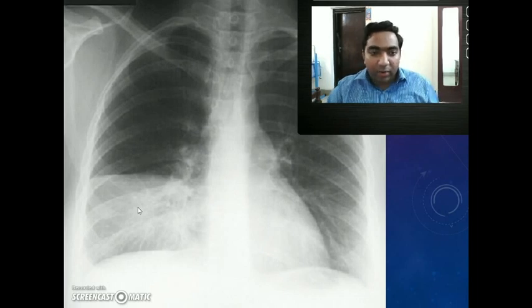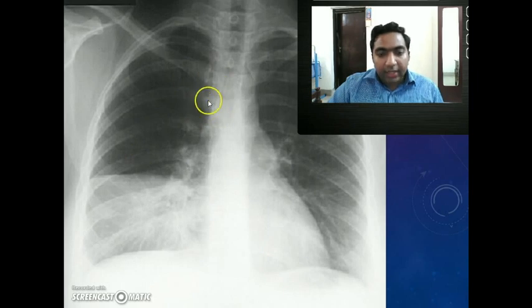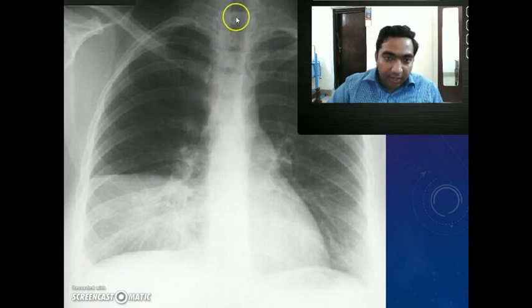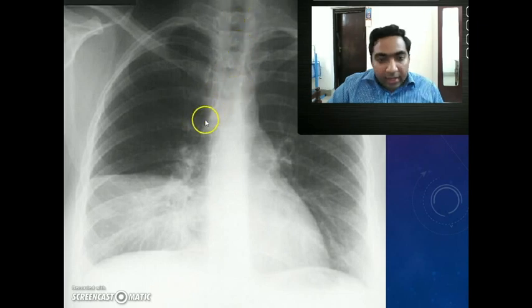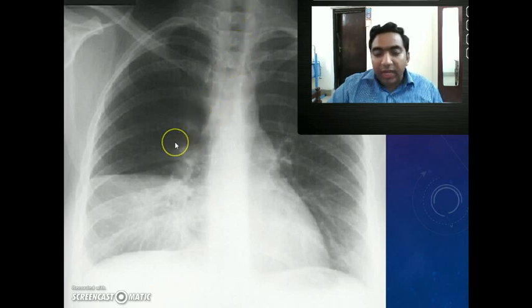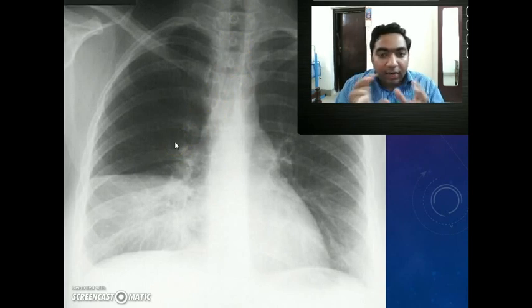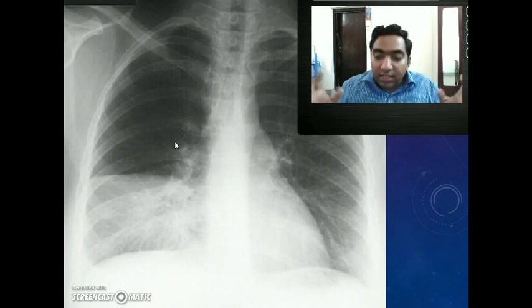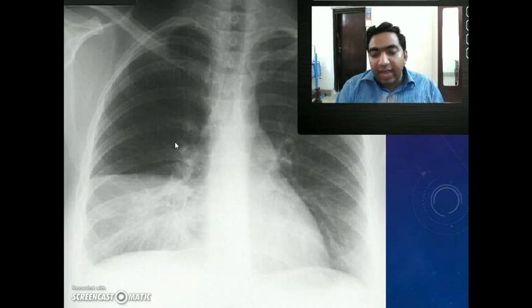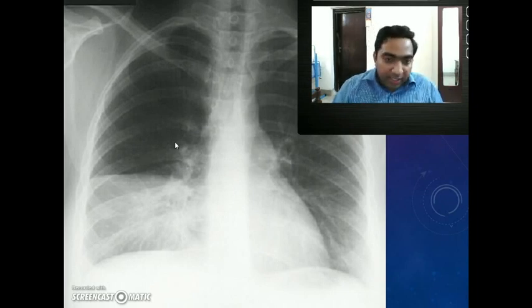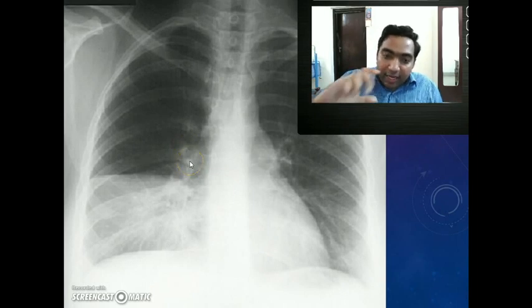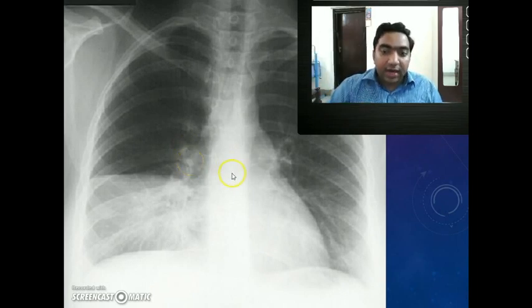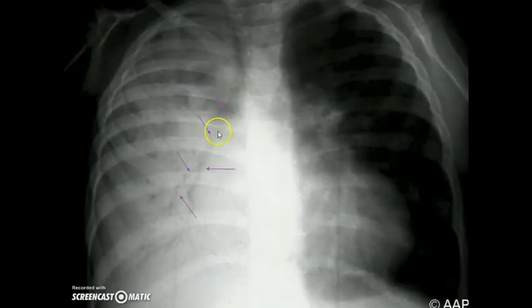What exactly is air bronchogram? There is a bronchus in the lung parenchyma. When the bronchus is in the trachea and mediastinum, we can clearly see the air. When the bronchus divides and enters the lung parenchyma, it is surrounded by air-filled alveoli — so we no longer see the margins of the bronchus because the air density in the bronchus and in the alveoli is the same. But once there is consolidation around the bronchus, we will start seeing the air shadow inside the bronchus. This is called air bronchogram, and it is suggestive of pneumonia.